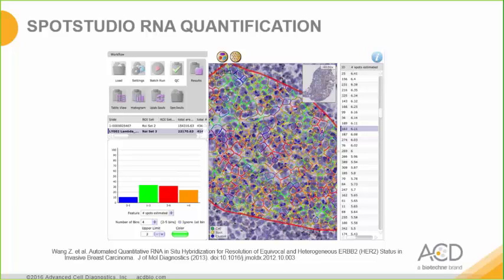In this situation, blue for cells with 0 to 1 dot, green for cells with 1 to 3 dots, red for cells with 3 to 6 dots, and orange for cells with greater than 6 dots. The results of the analysis for this region of interest show that the majority of cells have at least 1 dot, with a little more than 30% of tumor cells containing 1 to 3 dots, and a little more than 30% of tumor cells containing 3 to 6 dots. Almost 25% of tumor cells have more than 6 dots, and about 10% have either 0 or 1 dot.